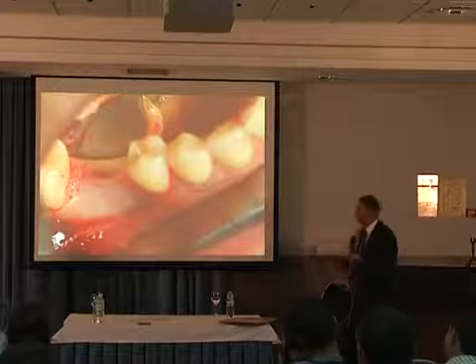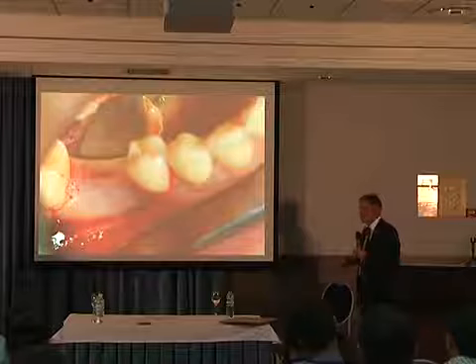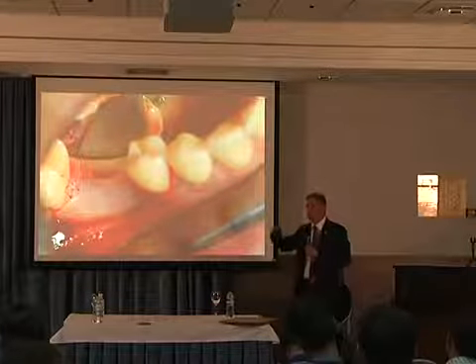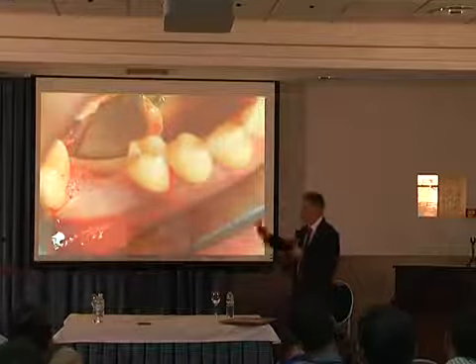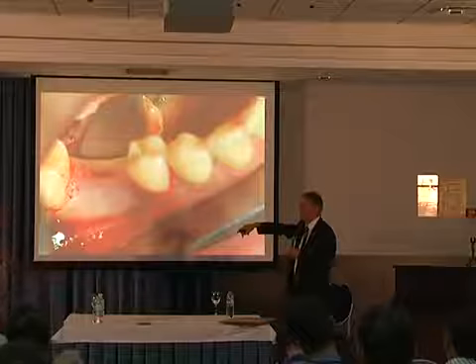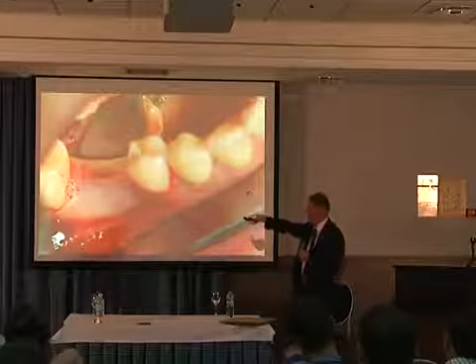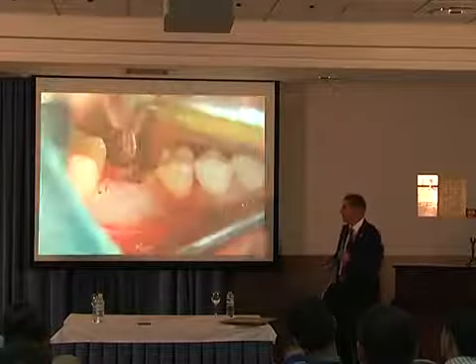The final preparation. Окончательная подготовка ложа под имплантат. And then we are going to make 2 drillings for our implant and then place the implant. The final bores. Now we start with 2 implant burrs. Burr 1, burr 2 implant. Okay. So far only piezo. This is only piezo here. I understand, but I mean the finish bores. Yeah, now we come with the implant.